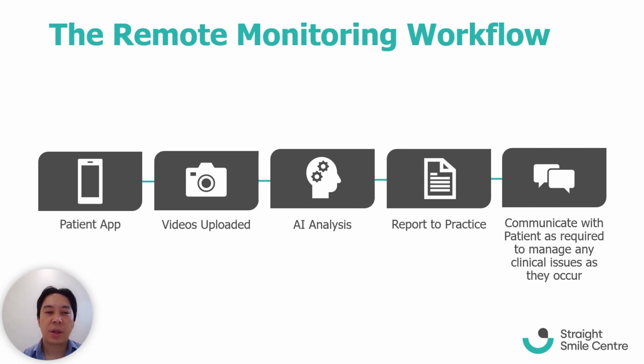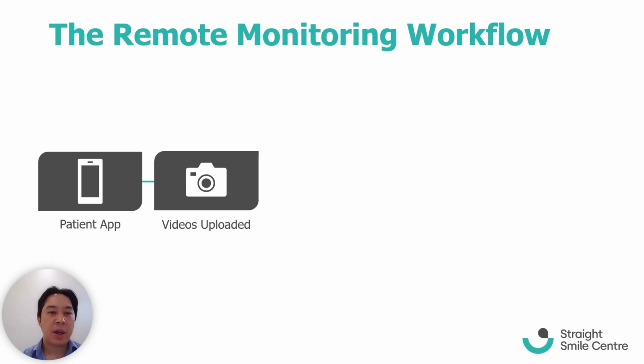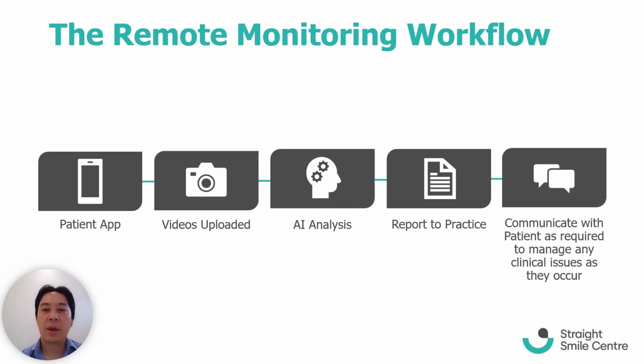So, to the workflow. The patient downloads the app, uses the app as instructed, and uploads the video. Artificial intelligence does the analysis, and then sends a report to the practice. The practice and the doctor assess the report and communicate with the parent and patient as required.